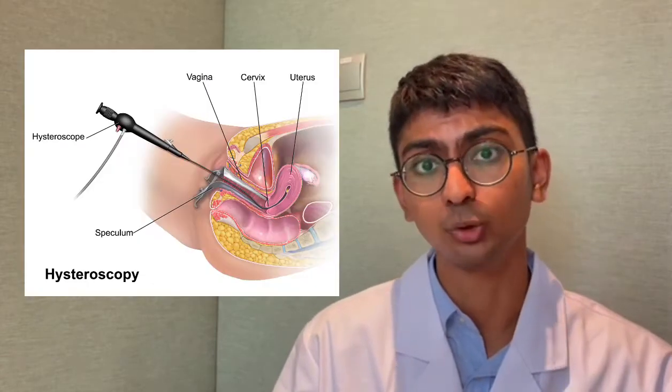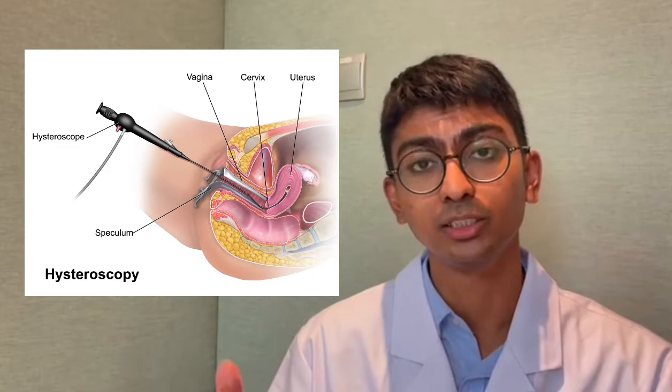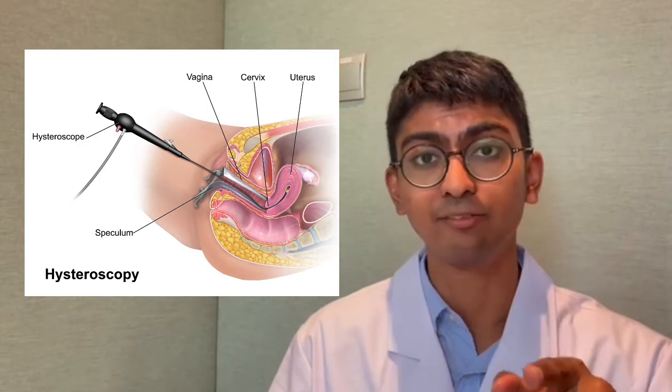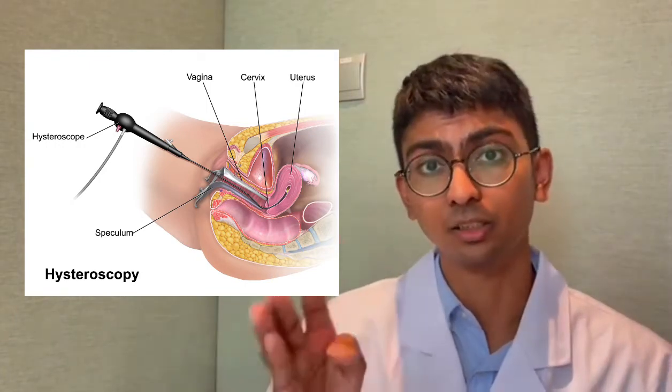How hysteroscopy works is that hysteroscopy is basically a surgery using a hysteroscope. A hysteroscope is basically an endoscope attached with a light source, a camera, surgical clippers, scissors, and other tools. And it accurately goes into the uterine cavity via the dilated cervix. And the biggest advantage that hysteroscopy offers is direct visualization.